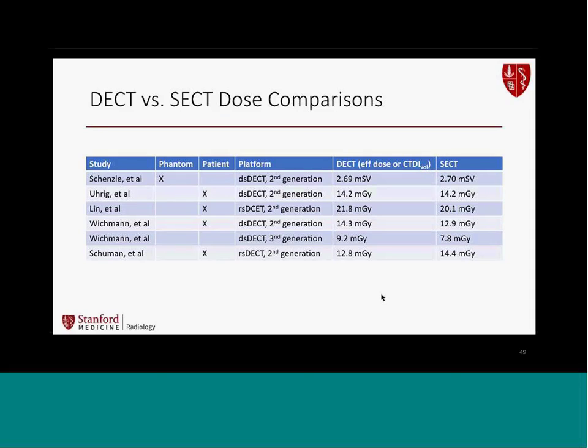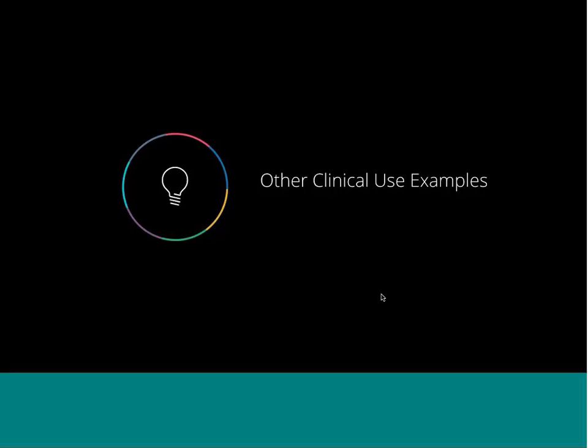But you know what? Who cares if they're not equivalent? I hate this argument because you're saying dual energy CT should be the same dose as single energy CT. Well, that's not really fair, right? Because with dual energy, you can get quantitative information. You're getting more information. My father taught me a long time ago, nothing is free in this world, but yet we expect that for this. So just keep in mind, this is an argument that we make to ensure that the referring physicians aren't upset, the patients aren't upset, and the public. We know that the radiation dose, this is not a big difference, number one. And even if it was plus or minus 10%, not a big deal. You're getting so much more information, and you're preventing the patient from having to get additional workup that is even more costly, okay? So I don't want you guys to worry about the radiation dose.